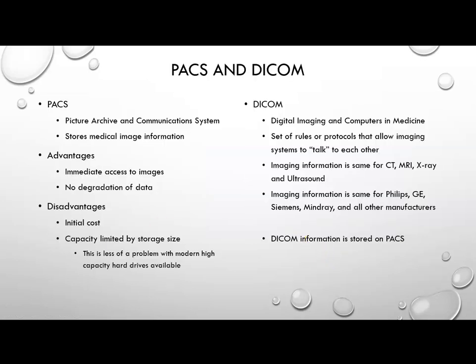All right, moving on to other display modalities. PACS and DICOM. So PACS is our method of storing pictures for long-term storage in medical situations. And PACS is what everyone uses today. We don't use film hardly at all anymore. I don't know of any hospitals or imaging centers that are using film that are not owned by old people that don't want to upgrade.